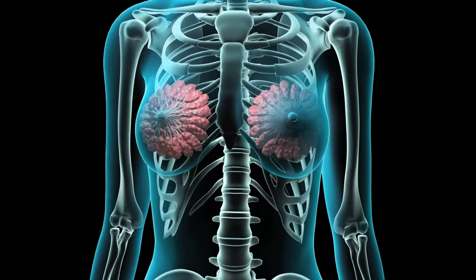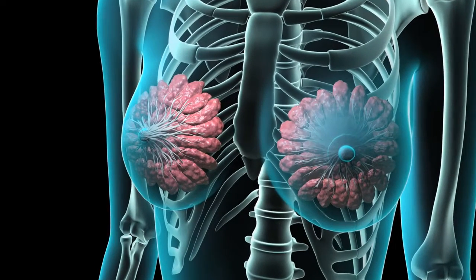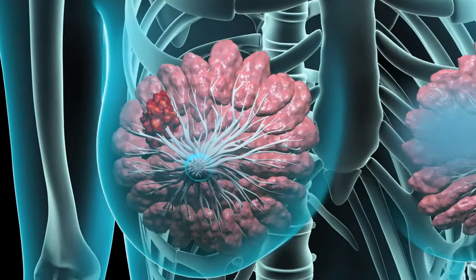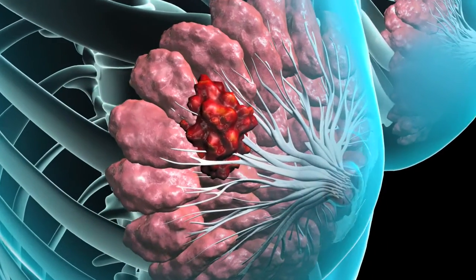A breast biopsy is usually performed to determine if a suspicious area or lump in your breast is cancerous. In this procedure, a sample of the suspicious tissue is removed so it can be examined in a laboratory.